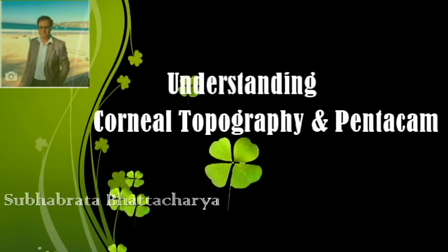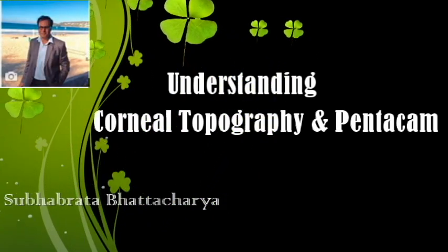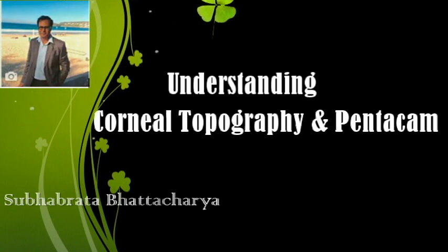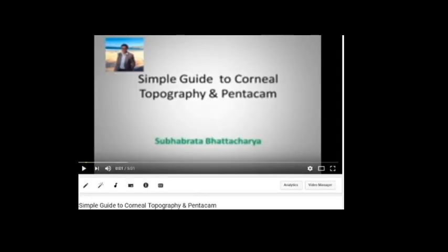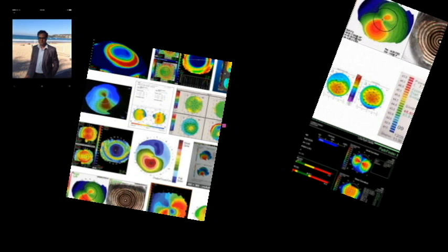Well, friends, welcome to this edition of Understanding Corneal Topography and Pentacam. My last presentation on this topic generated a lot of viewership and interest. I understand that there are a lot of tomographers and topographers in the market with a lot of data that we can generate and get at our fingertips. It is very important that we understand these tomographers and topographers in a systematic way, try to simplify it, and understand what we need to do to improve patient outcomes.